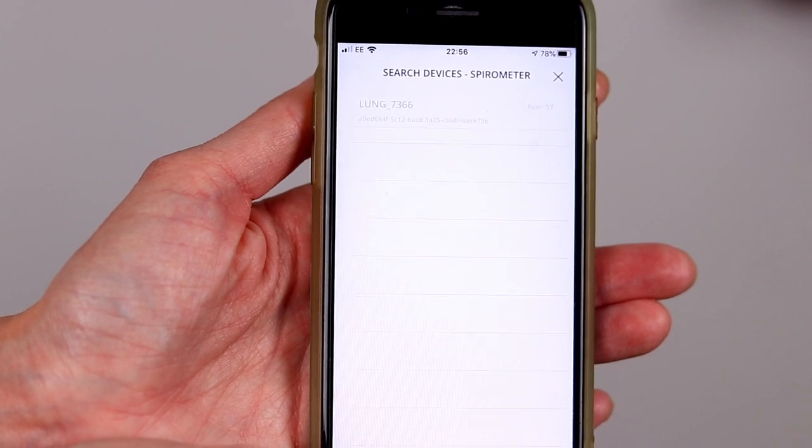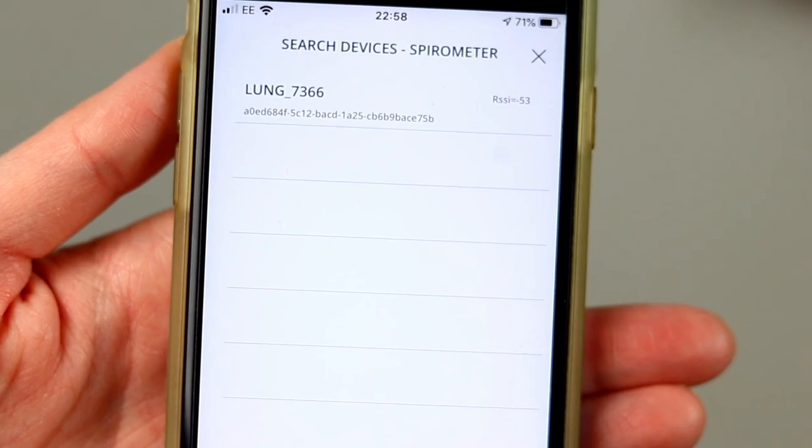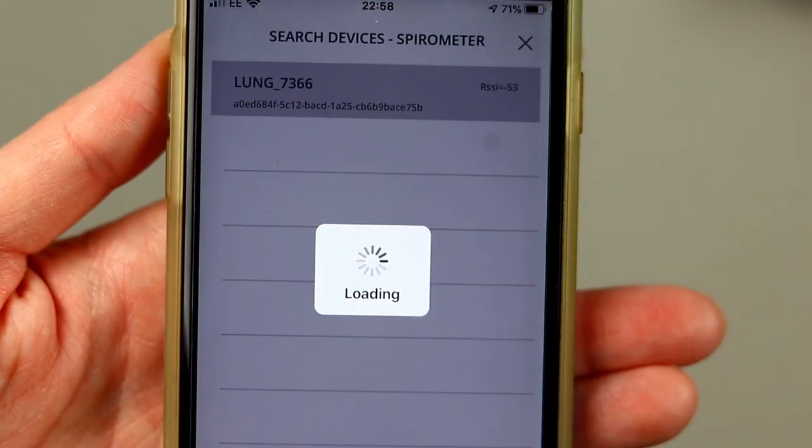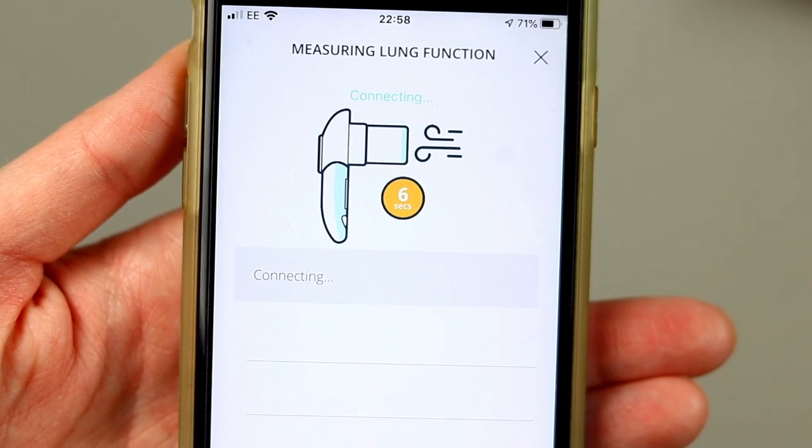The app will begin a search and list the spirometer available. You should see one with the name lung underscore and a number, like we have right here. Tap this and your spirometer is connected to your Breathe app. And that's it — you're all set up and ready to record your first blow.